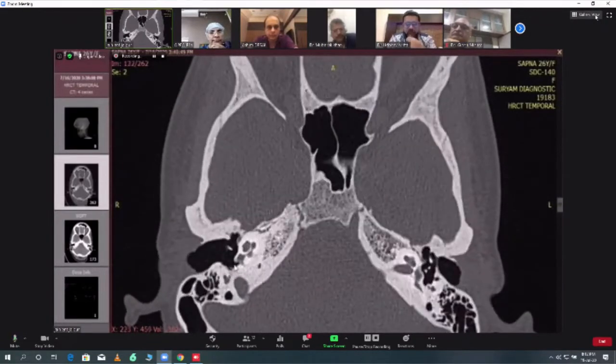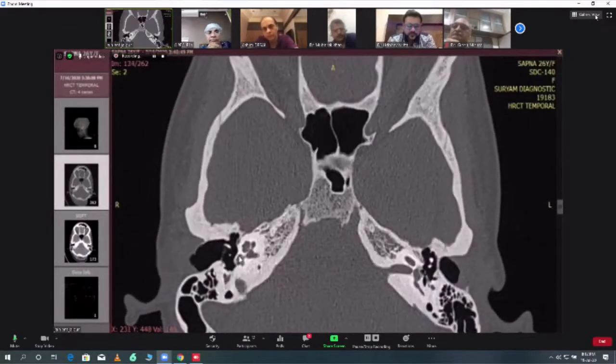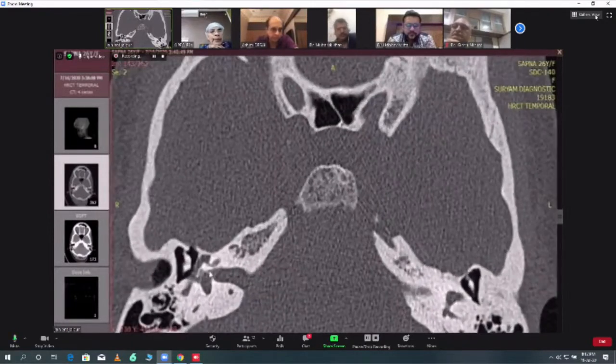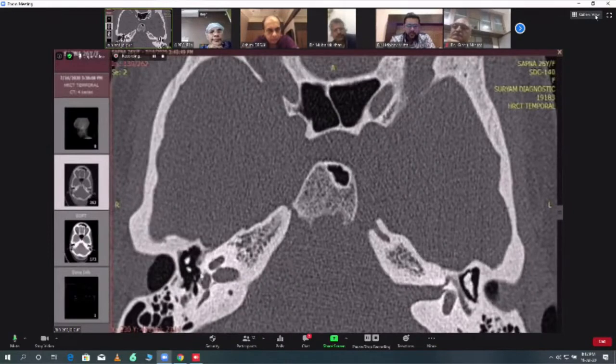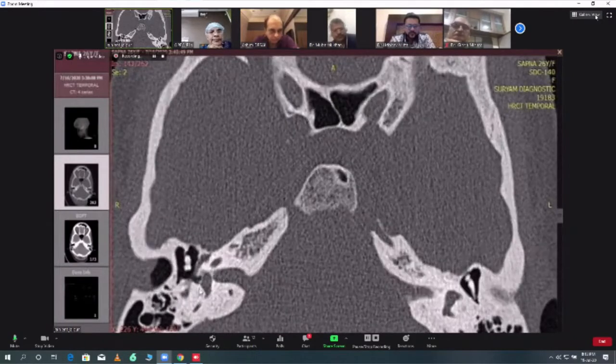So no third window lesion, inner ear is normal, ossicular chain looks normal, the facial is normal, no overhang. And this is a small focus, if you see carefully. This is a small focus, that is otosclerosis here. Very nice. Fissula ante fenestram, see this. Wonderful. Classic fenestral otosclerosis. See this small hypodense area, if you can appreciate. Clearly seen, and this is the stapes. The vestibule is absolutely normal.